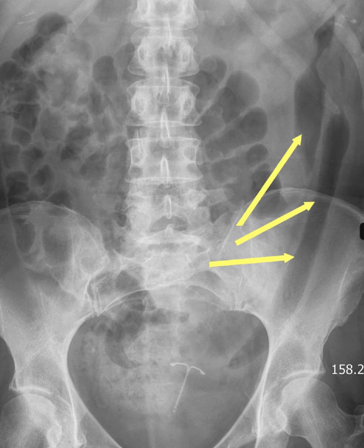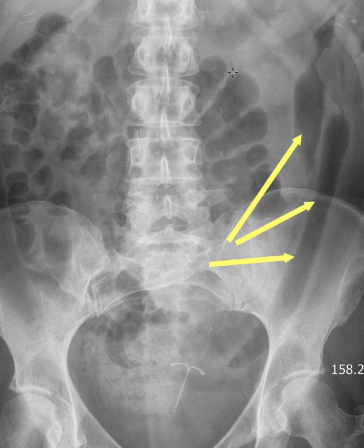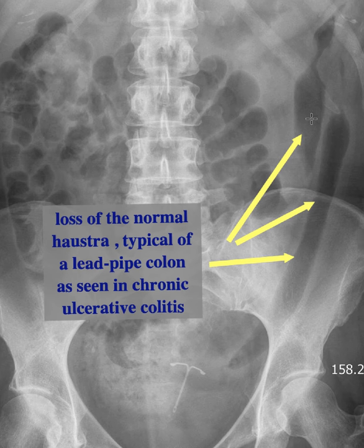The major abnormality here is the colon on the left side of the abdomen. You can see that it's missing the normal haustra, which are the rounded indentations that you see in the normal colon. Instead, the colon is very featureless, almost straight. There is thickening of the wall of the colon indicating a bit of edema.